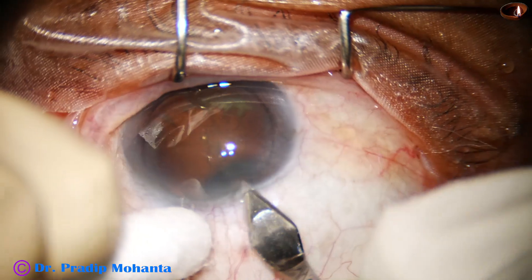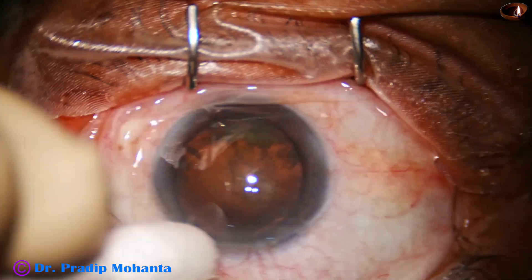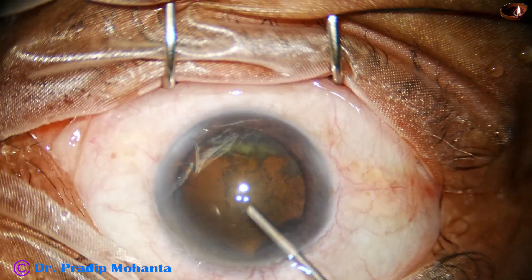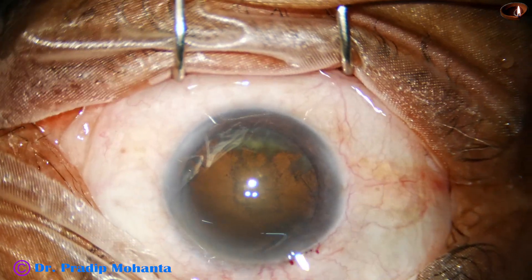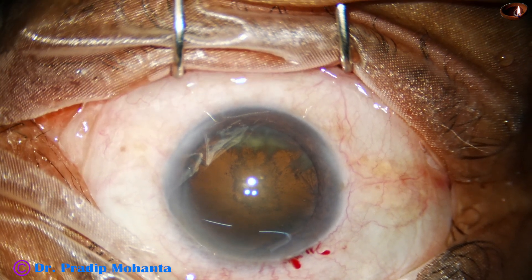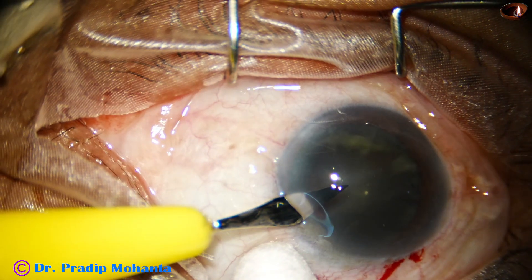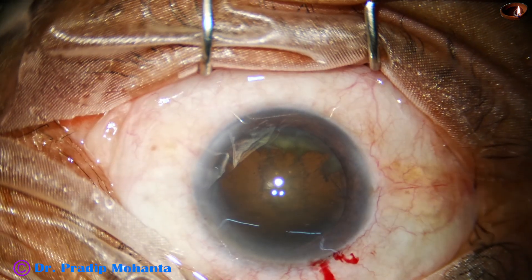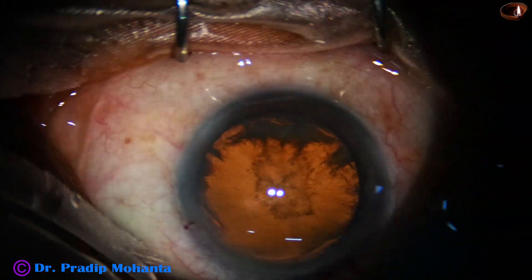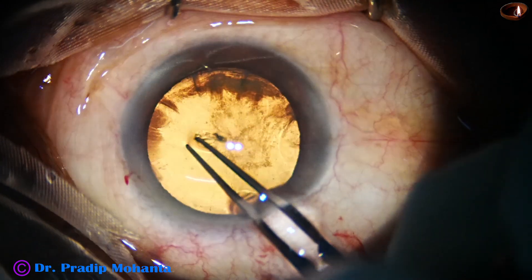This is the main incision with a 2.8 millimeter steel keratome at around 11 o'clock. The anterior chamber is filled up with viscoelastic substance. A side port is made on the left side of the main wound, about three o'clock hours away. Some capillaries are included in the incisions so that there is some oozing of blood.